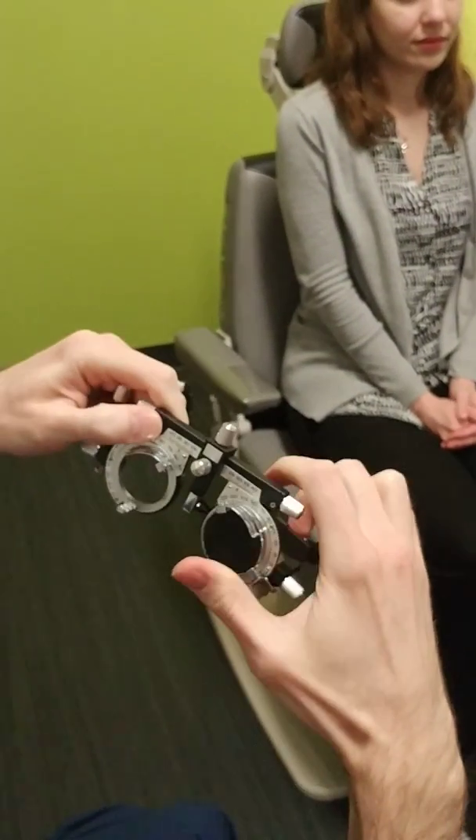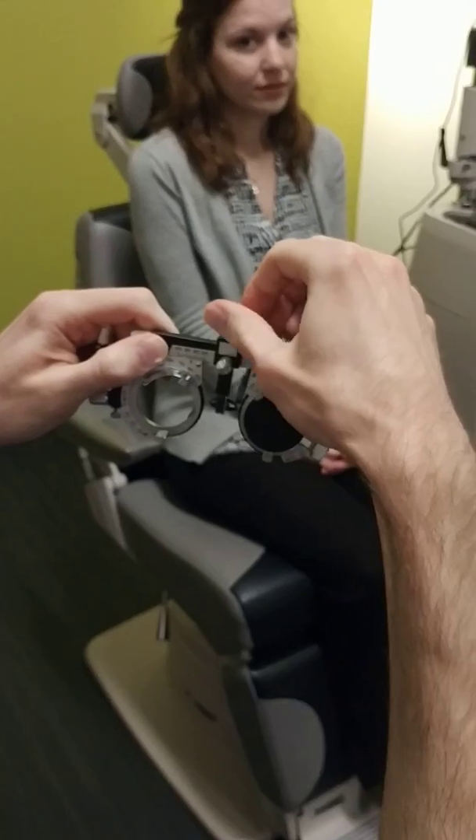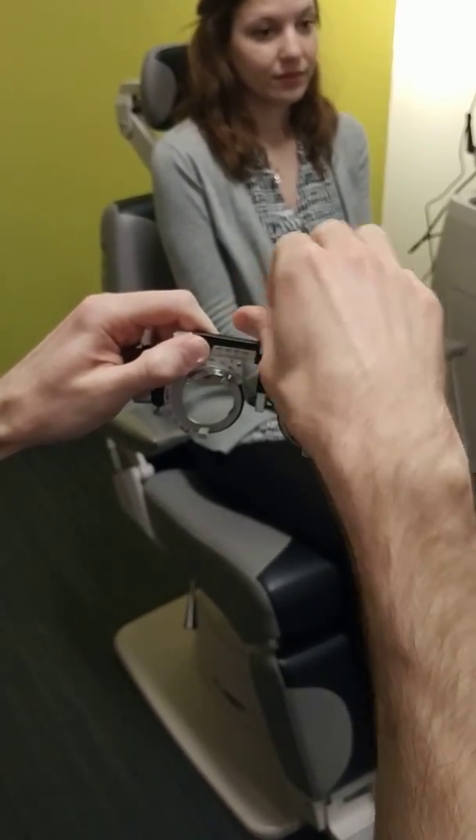The next one, which actually ends up being pretty important, is the height adjuster. You can see that you can move the height up and down by moving the middle knob here.